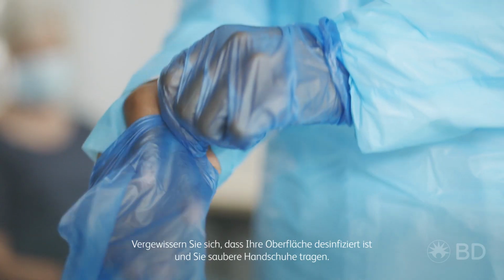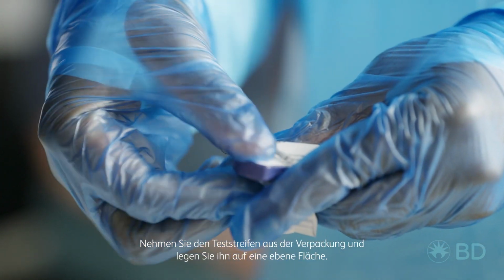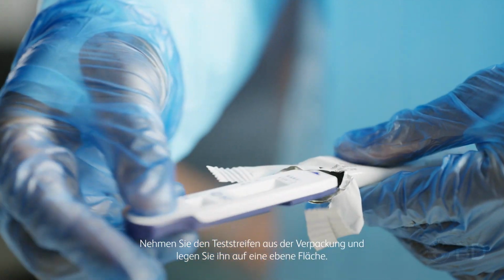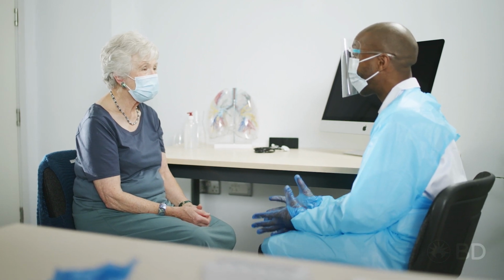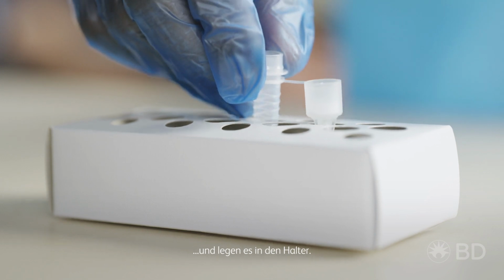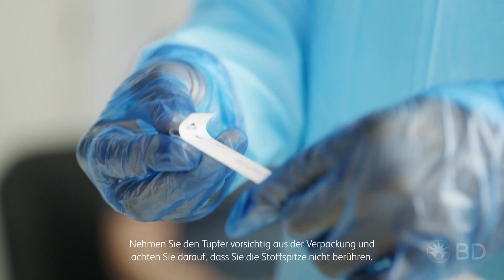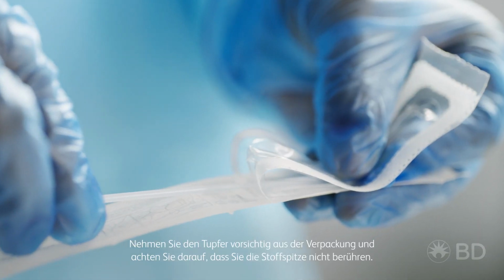Check your surface is sanitized and you have clean gloves on. Remove the test strip from its package and place it on your flat surface. Take the tube, remove the yellow cap, and place it in the holder. Gently remove the swab from its package, being careful not to touch the fabric tip.